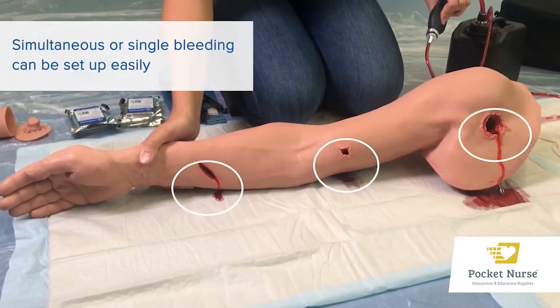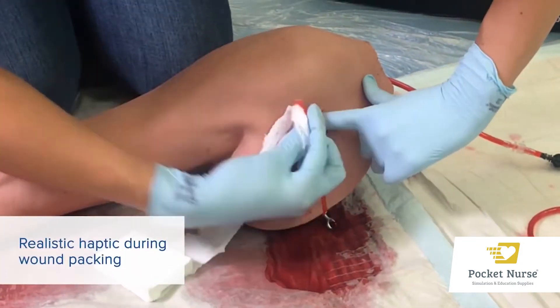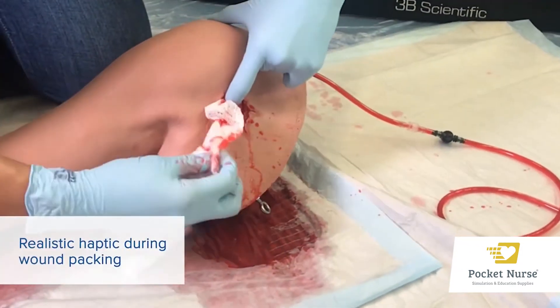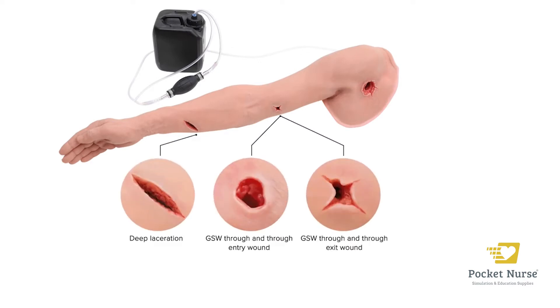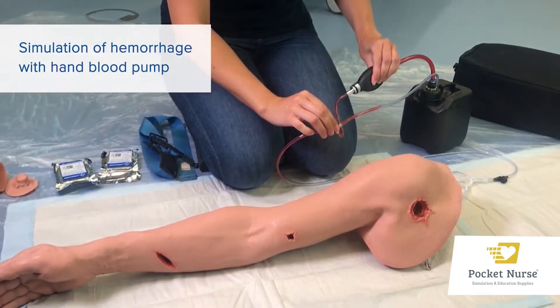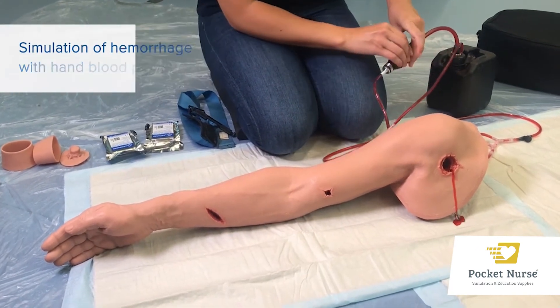Ideal for teaching tactical combat casualty care and civilian casualty care, this arm trainer is equipped with four different wounds which include a deep laceration or stab wound, a large caliber gunshot with entry and exit wounds, and a junctional wound in the shoulder area. The bleeding of each wound is controlled with a 2-liter manual blood pump system.